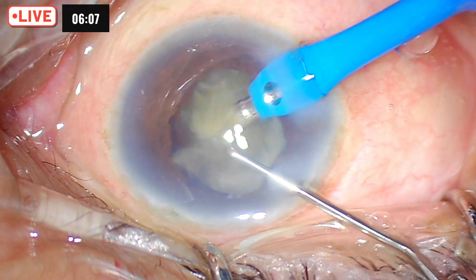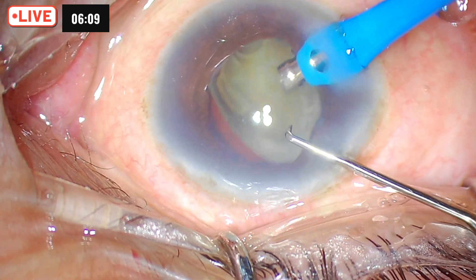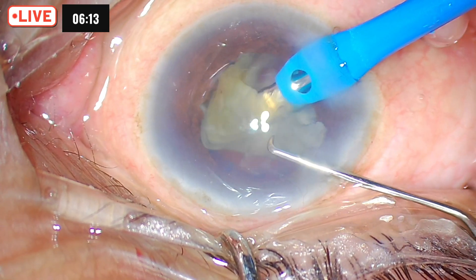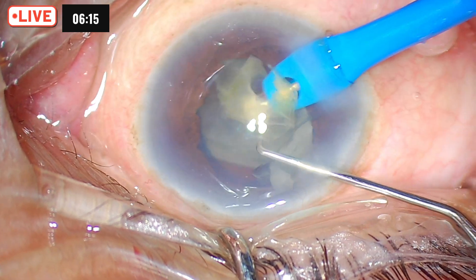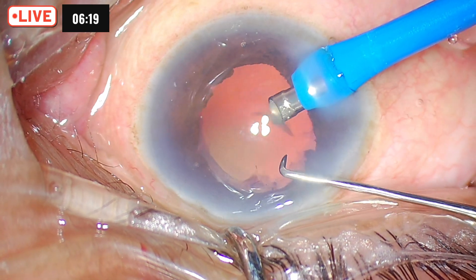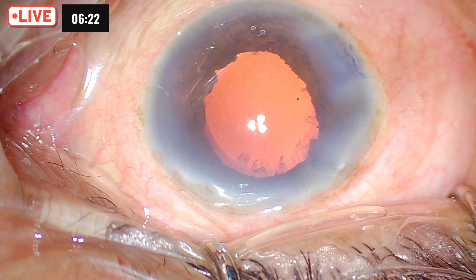We are nearly through. As expected, there is not much cortical matter in this patient — it was a hypermature cataract. The cornea is decompensated, so we are doing low phaco and trying to do everything in the iris plane.